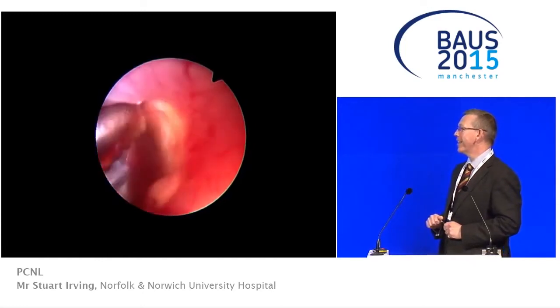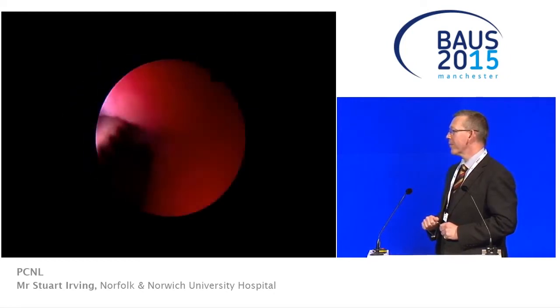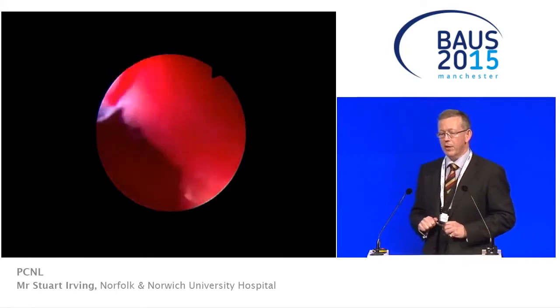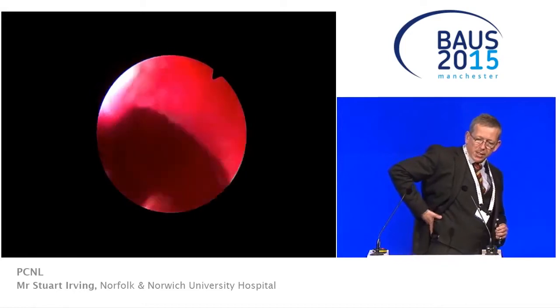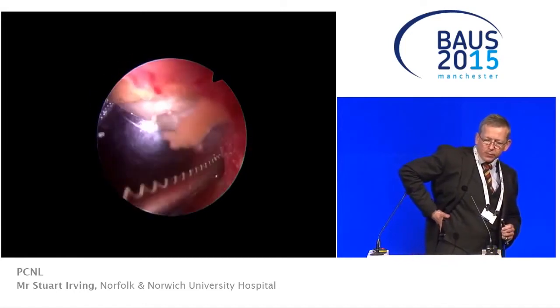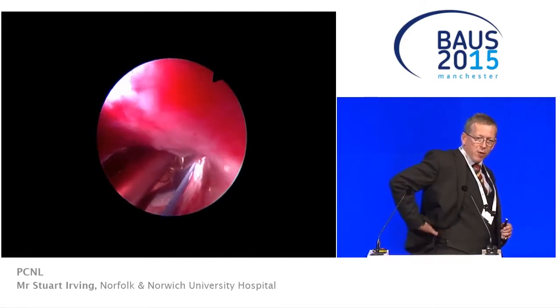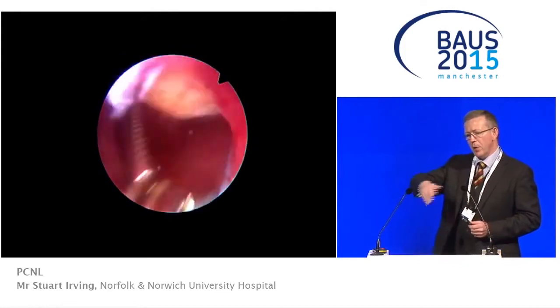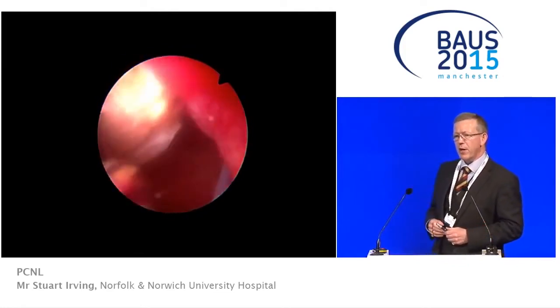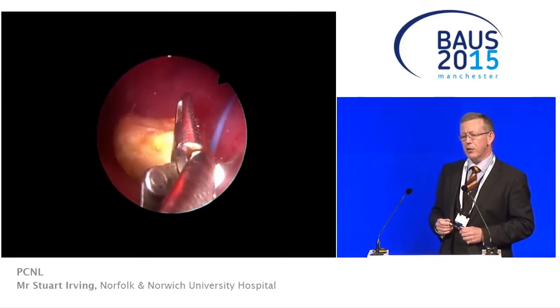And when it's appropriate with the video, there's been a couple of questions asking you to explain the positioning for a supine PCNL. We use a modified Galdakao-Valdivia position. This uses a 2-litre saline bag under the loin, but we prefer to use 2 smaller bags so we can get a bit more access round to the back of the loin. We'd like to find a table which had a scalloped edge, because we find that the positioning on the edge of the table can again be slightly challenging.